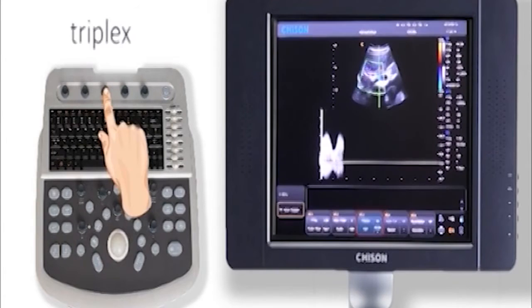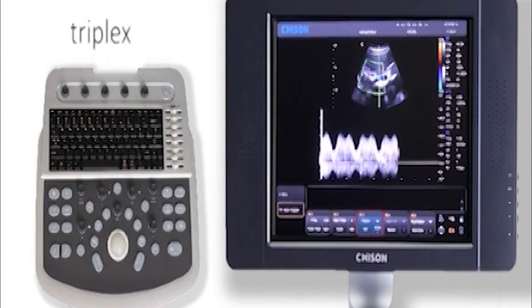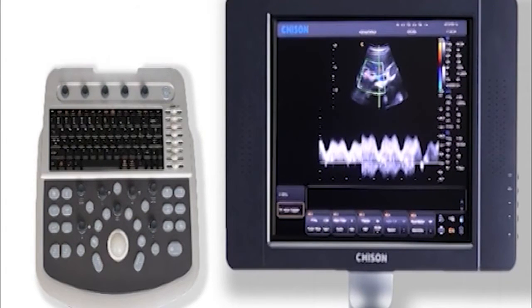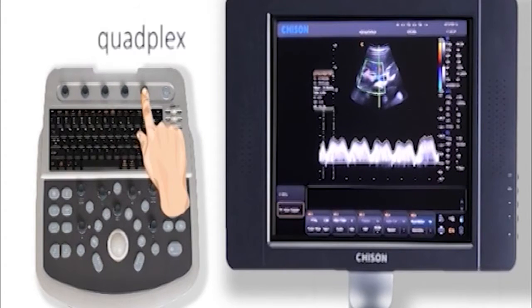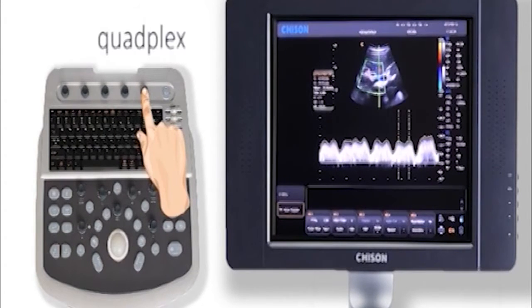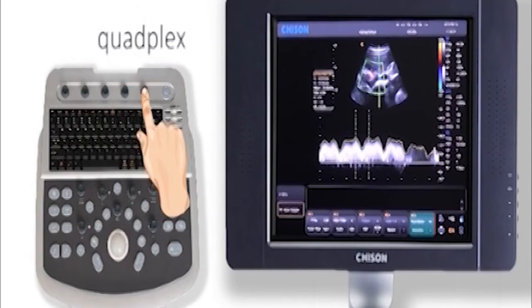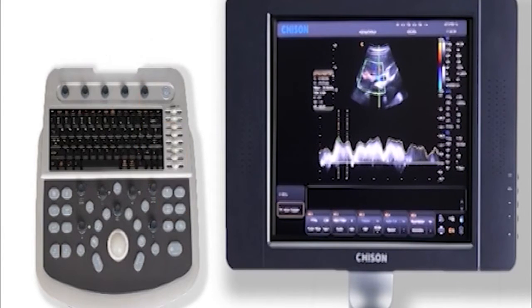Press the triplex key to open triplex function. Press the quadplex key to open quadplex function. It will display the major results in real time.